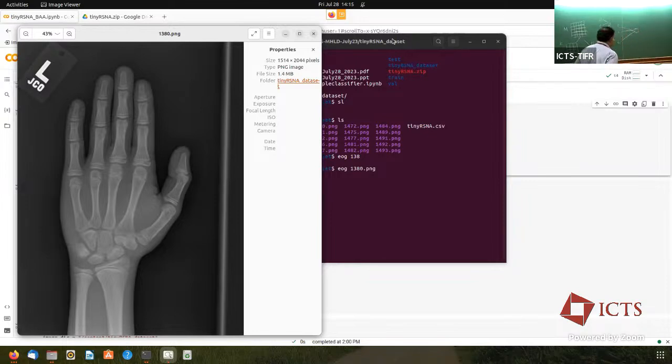ResNet 18 and ResNet 50 are very good networks. By default, the first model of choice is ResNet 18. If you want to get deeper into what a residual network is, how it differs from some of the older models, and what's new in the newer models, you can come and talk to me afterwards. My goal here is to get you up and running so that you can do a basic script to run a regression network and start to see if the error is reasonable or not. All right. So that's essentially what I want to say about this.